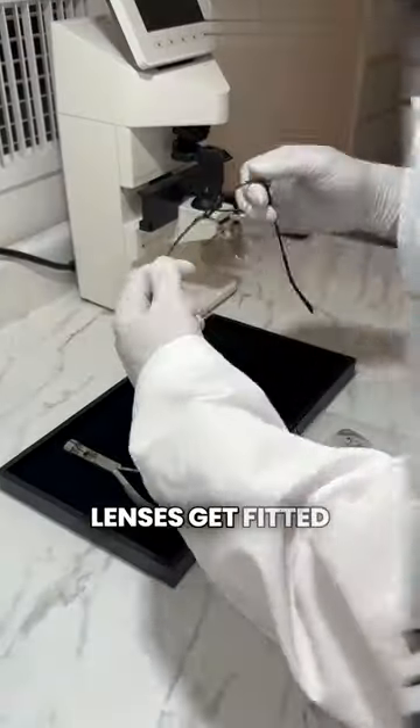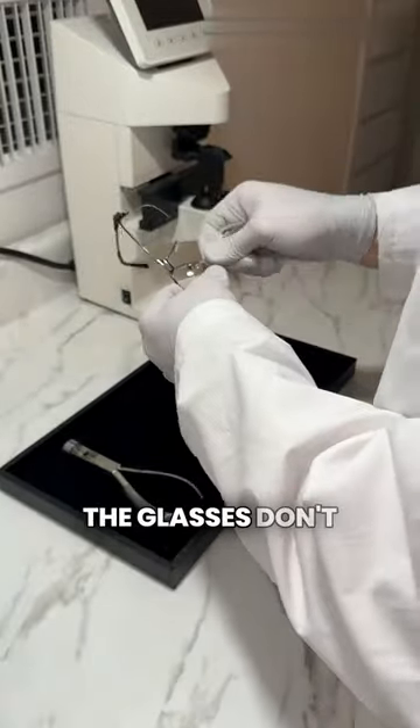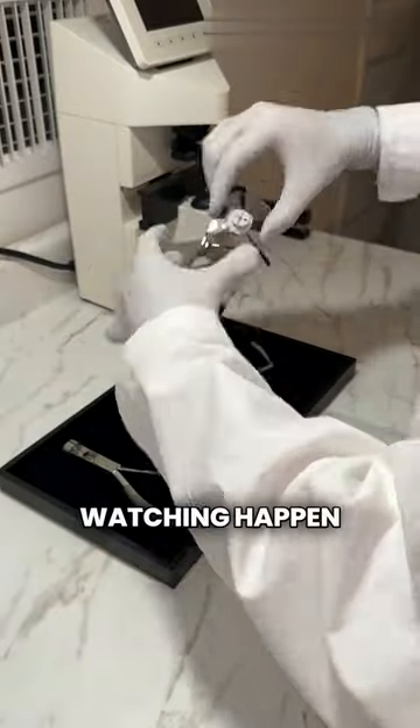Now we're going to watch the lenses get fitted into the frame. Since these glasses are semi-rimless — meaning the glasses don't have any rim on the bottom of the lens — they need to be fitted with a band that holds the lenses into place, which is what you're watching happen right now.